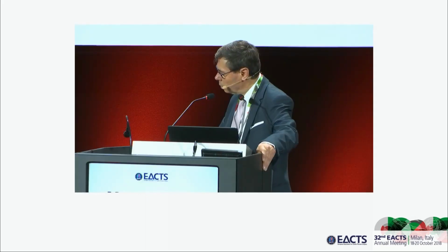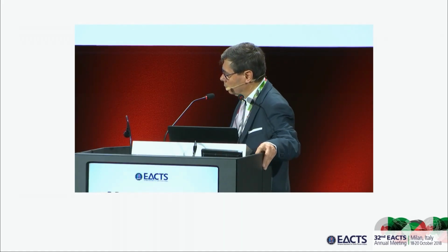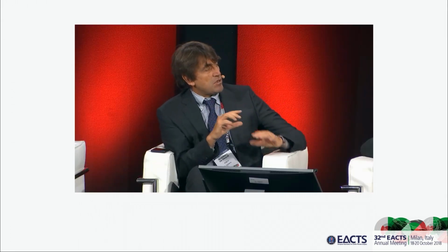But in case you don't have any aortic regurgitation at the end of the operation, even though you don't find the perfect lower coaptation in one couple of leaflets as compared to the other one, how does it influence the next step? Does this information help the surgeon to do something or not in the post-repair? Just the measurement of the different coaptation between two different leaflets.